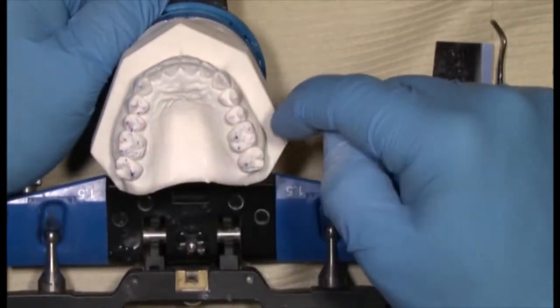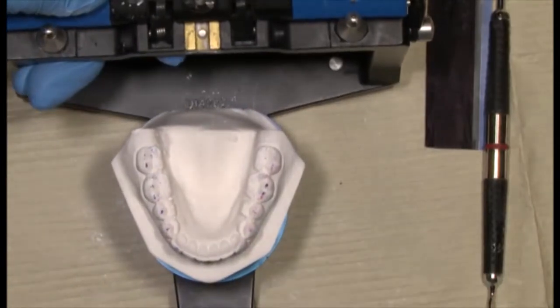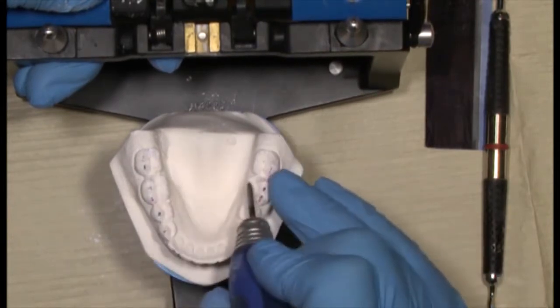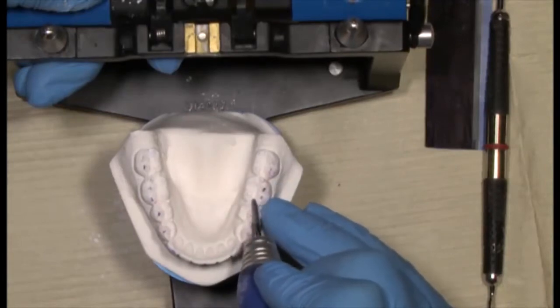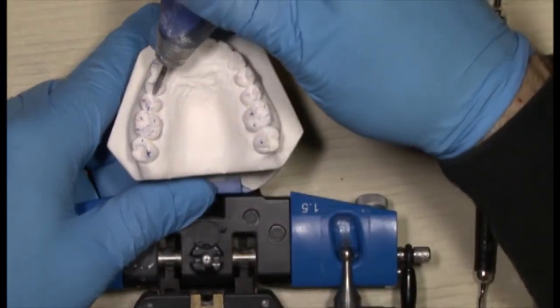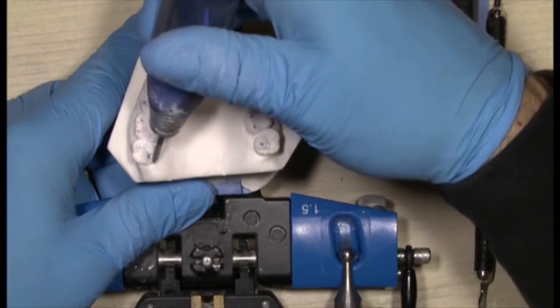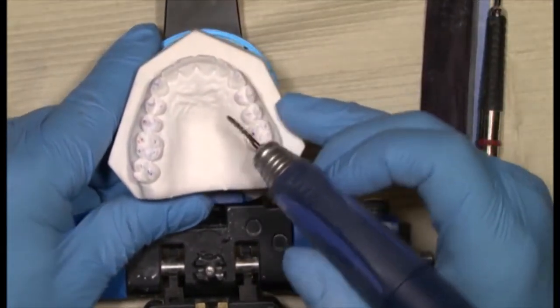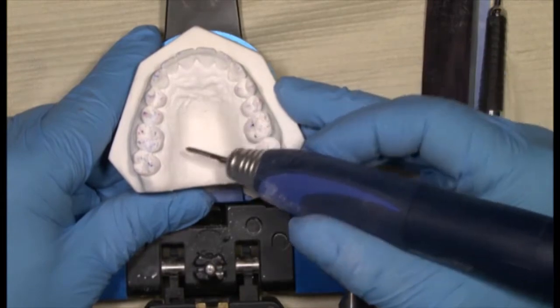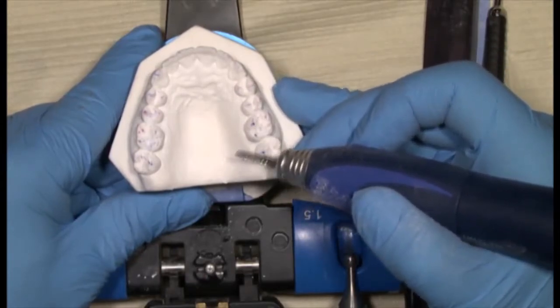Clear marks through the bicuspids. Still, it looks almost the same on the other side. Remember, what you're trying to do with the trial equilibration is not necessarily mimic exactly how it will go in the mouth, but at least get an idea of what you'll be up against when you try to do this in the mouth. And my point is, this left side is going to take a lot longer to get into contact before we actually get this accomplished. So the right side came into contact fairly quickly, but the left side did not. It's the same thing that should happen in the mouth.